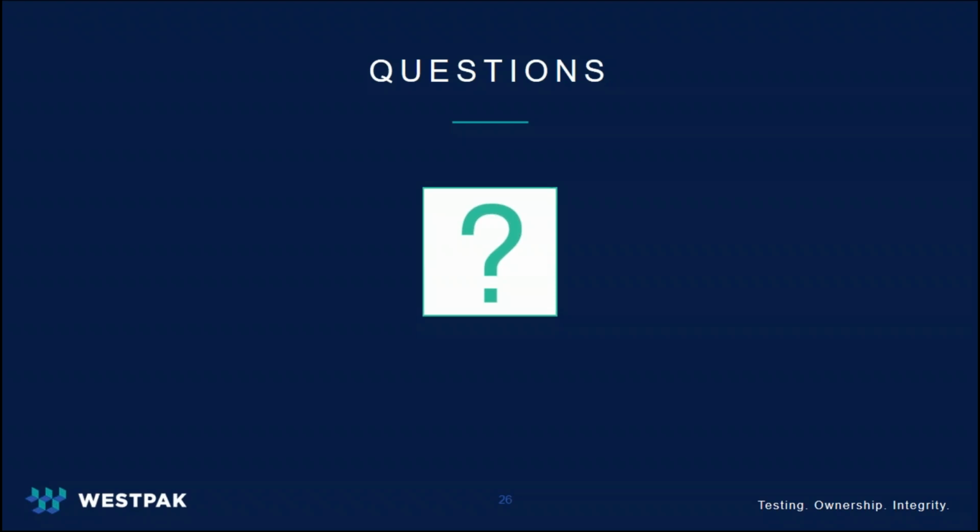Next question, are there patches or stickers you can attach to problem areas common to pinholes? I would recommend not applying anything to the outside of the packaging and instead focus on the protruding objects within the packaging to prevent this type of failure. And if you would like, you can reach out to us after the webinar so that we can talk about your specific packaging design or anything that is an issue.